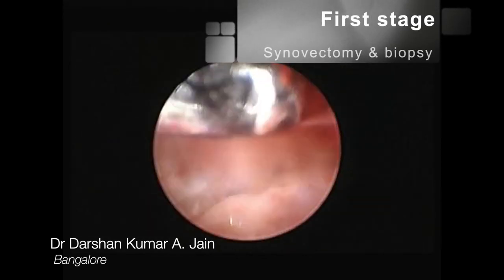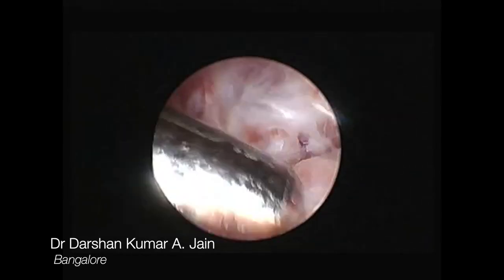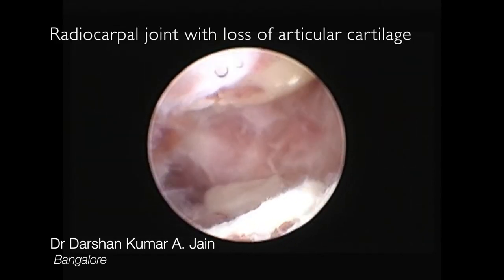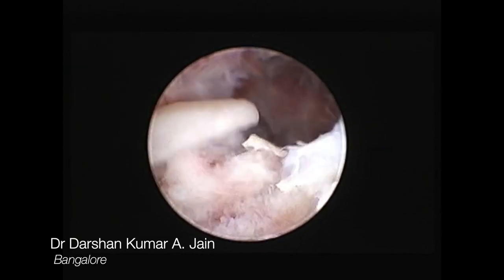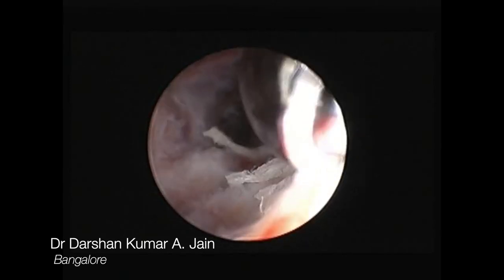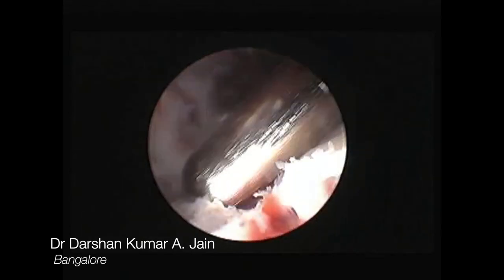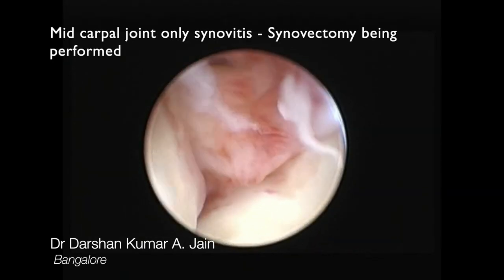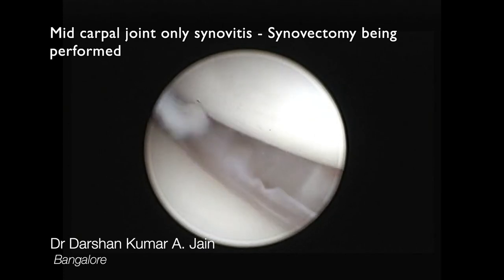Initially an arthroscopy was done where synovectomy was performed and biopsy was sent. There was extensive loss of articular cartilage at the radiocarpal joint, which was debrided, and subsequently midcarpal joint inspection was done, which showed good articular cartilage but extensive synovitis of the midcarpal joint as well.